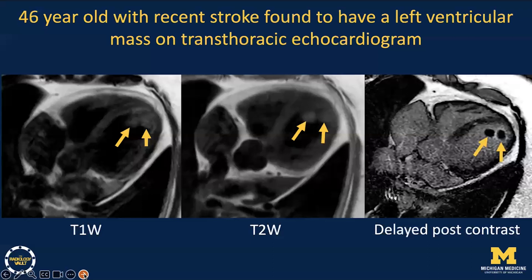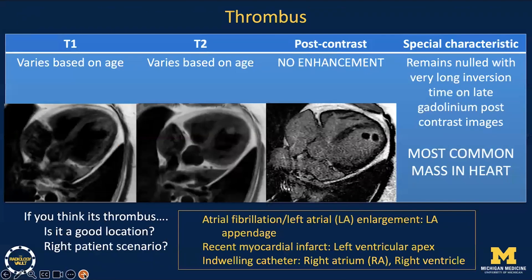This is our first case: a 46-year-old with recent stroke, found to have a left ventricular mass on echo. The diagnosis is thrombus. Thrombus can have variable signal on T1 and T2-weighted sequences, and the key to diagnosis is that thrombus does not typically enhance. This lack of enhancement can be confirmed on the delayed inversion recovery sequence by repeating an image through a slice of the mass with a very long inversion time on the order of 600 milliseconds. Thrombus is the most common mass identified within the heart, and specific clinical scenarios can also help the imager provide a confident diagnosis.